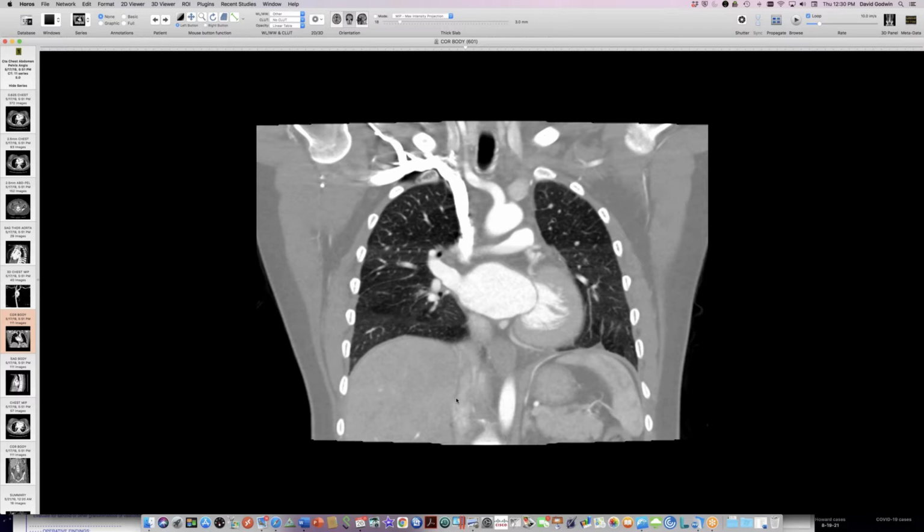David, this patient you said was only like 4'5". Any idea how big her aortic annulus was? I'm surprised that they were able to get a small enough TAVR valve to go in there, because I'm guessing it's a small annulus. I'll see if I can get the measurements. Just curious.